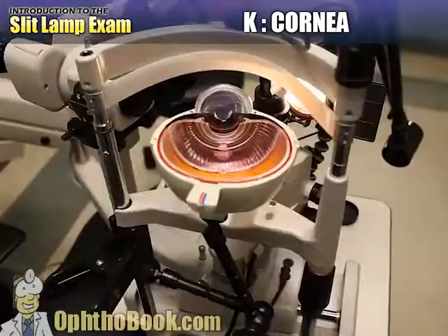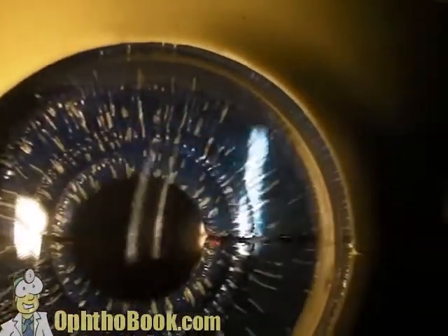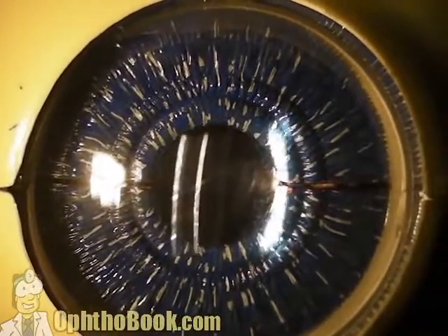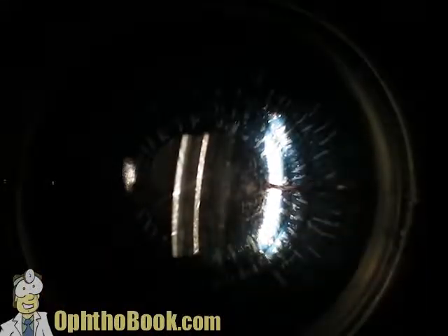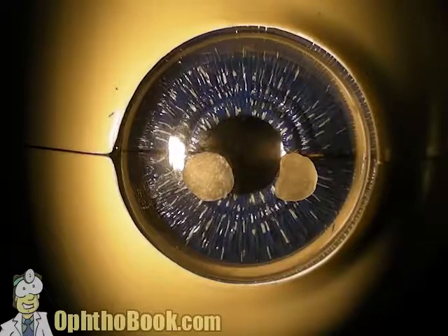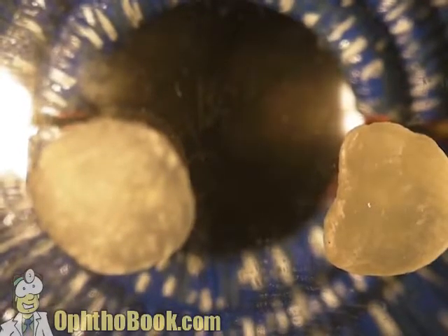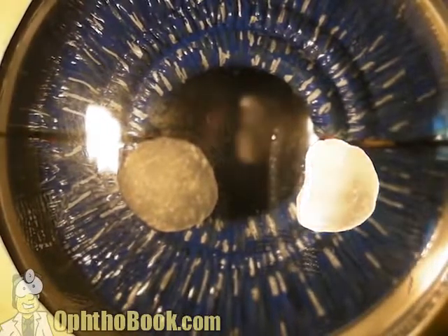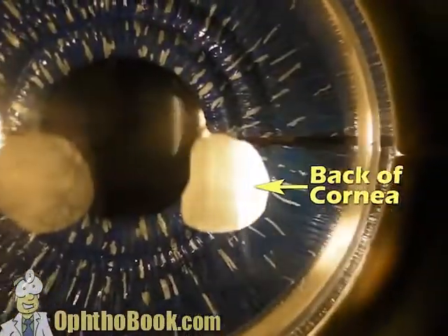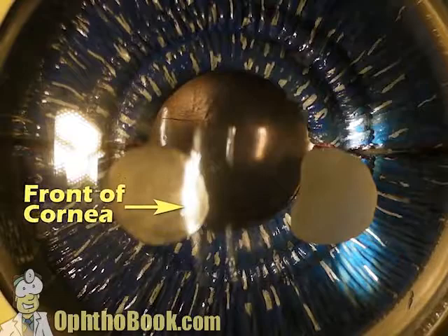And then we move on to the cornea — that clear window in the front part of the eye. We're going to switch to a different model. Clear structures like the cornea are really where the slit lamp comes of age, because you can get a cross-sectional beam and look at the cornea in fine detail. You can see the front of the cornea, the back of the cornea, and the middle. It's really nice to have that cross-section to track down lesions and judge depth — determining whether a lesion is on the outside or inside of the cornea by using our cross-sectional beam.